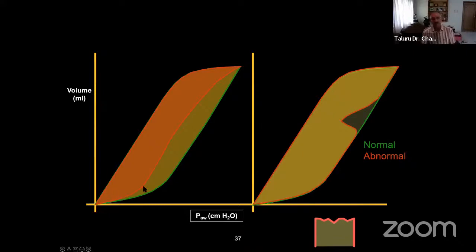Even this is a graph which shows improper flow. Pressurization is not very adequate. So probably if this patient is on a pressure support, it is not going smooth, it is going here, or there are some small aberrations like this, probably you have to increase the peak flows or the rise time. And the flow versus time, it looks like this.